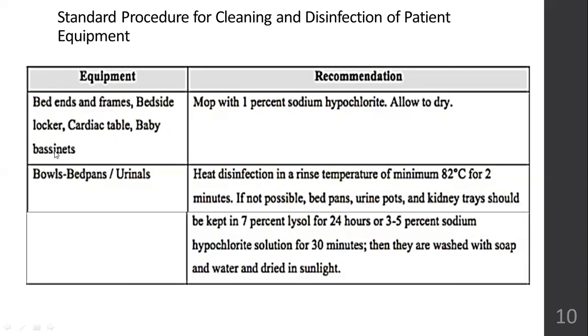Bedpans, urinals. You have to use heat to disinfect these. Okay, 82 degrees Celsius at least. Hot water should be used for 2 minutes, and if that is not possible, it should be kept in 7% Lysol solution for 24 hours, an entire day.